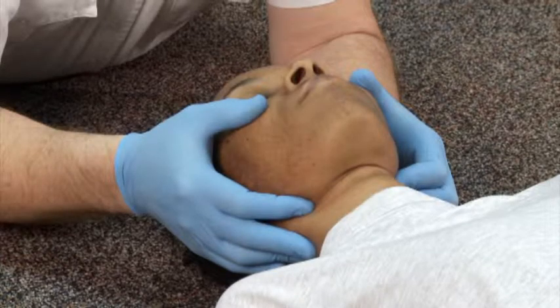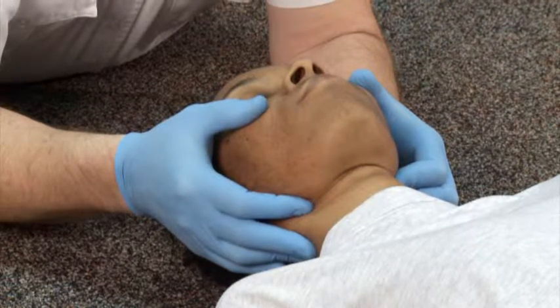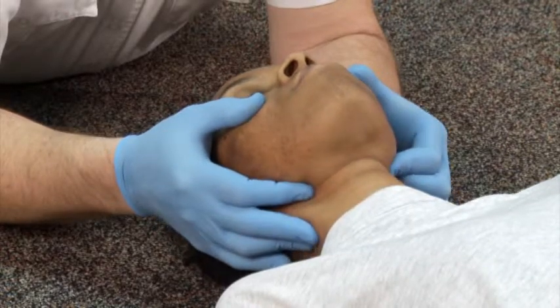This video will demonstrate the placement of a nasopharyngeal airway, or NPA, when two providers are available. The first provider brings the patient's head and neck into a neutral inline position and maintains stabilization while opening the patient's airway with a trauma jaw thrust maneuver.